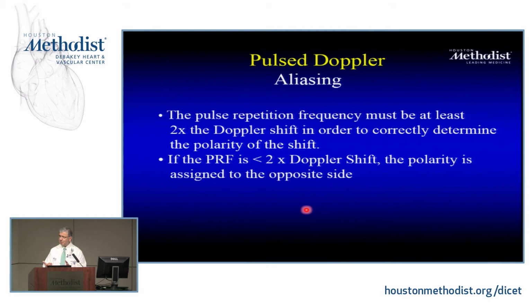Well, there's a limitation to pulse Doppler. If the velocity is very high, I'm not going to be able to resolve it. So at least I need my pulse repetition frequency. This is a term you need to know. Pulse repetition frequency is how often I can send this pulse and listen. Send, listen, send, listen. You can tell already if I'm closer to the transducer, my pulse repetition frequency can be much faster. If I'm further out, I have to wait a little longer.